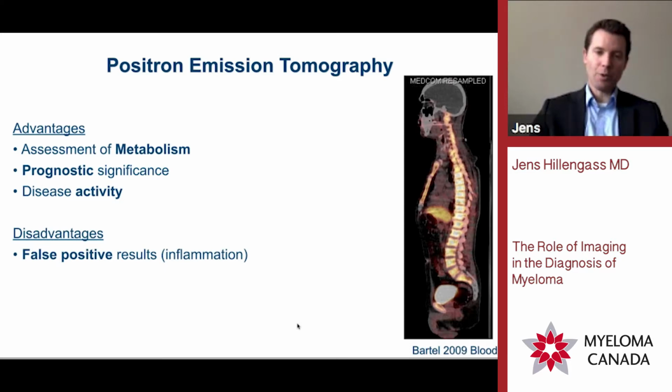Disadvantage, it can have false positive results. I already mentioned that also inflammation, which is also not uncommon in myeloma, can cause changes that are not able to be differentiated in PET-CT, at least not with the so-called tracers, which are the contrast agents we use nowadays.